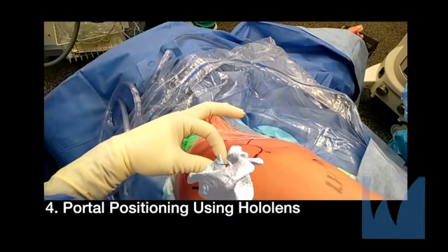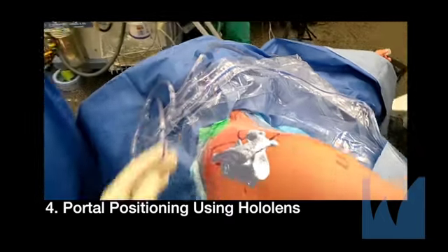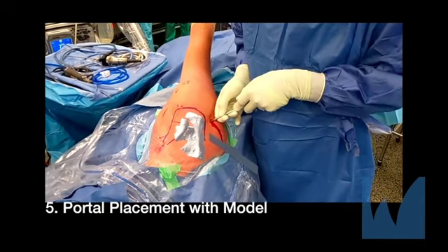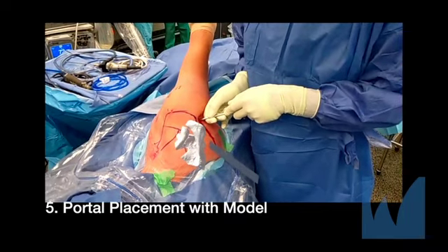Using the HoloLens, a 3D model of the shoulder can be positioned to assist with portal planning. In addition, the HoloLens enhances the accuracy of portal placement by allowing for visualization of the 3D model.